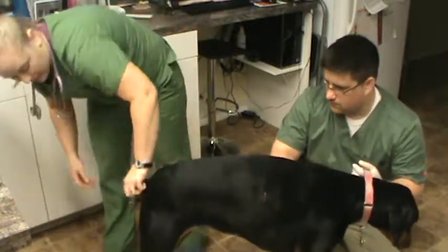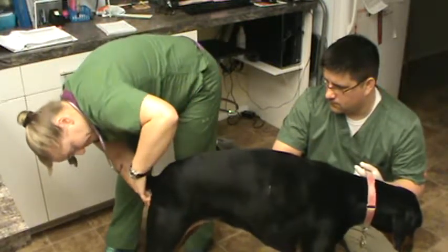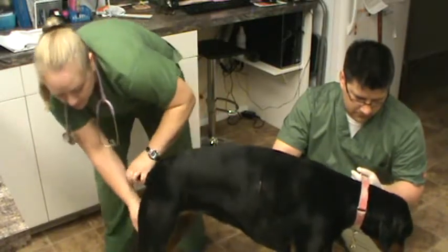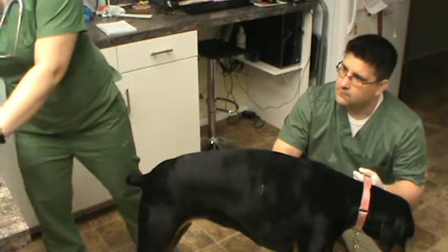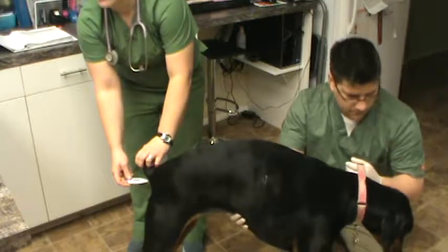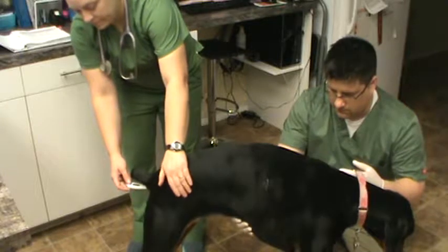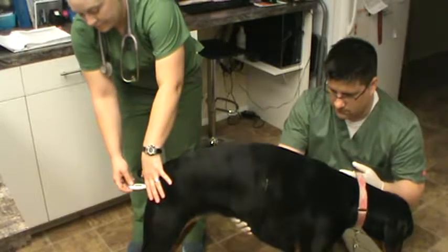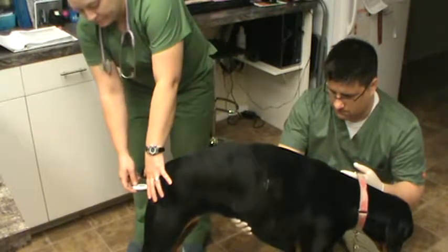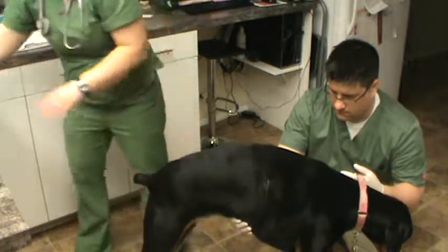I'm going to go ahead and check genitourinary tract. Rectum looks normal. And vulva and surrounding structures are normal. I'm going to go ahead and get her temp with our rectal thermometer. Okay, and the temp is 100.9.